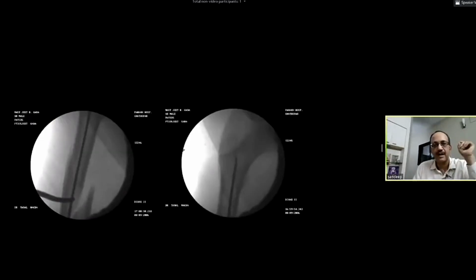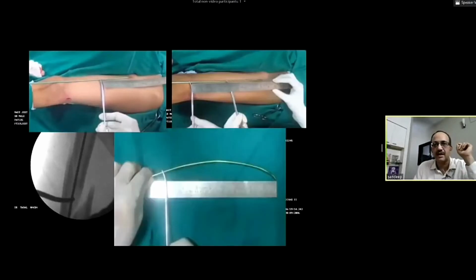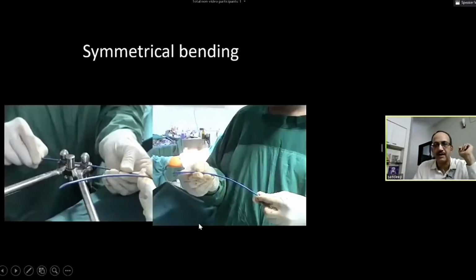An example here: the artery forceps is showing you the apex where the bend should be, and then you bend it 3 times the inner diameter. That is how you choose it, and then the apex is bent exactly there. This is the nail chosen. Now this nail should be bent equally on both sides of the apex. The rest of the nail need not be bent. So it is not that you have to bend the whole nail. The rest of the nail can be straight, but there should be an equal bend on both sides depending on the apex of the bend.